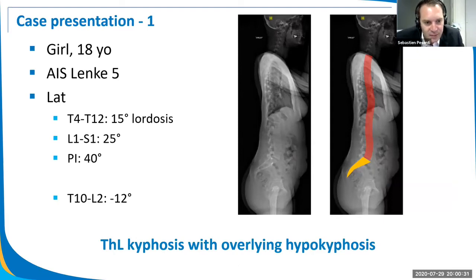And there is a thoracolumbar kyphosis of 12 degrees that corresponds to the apex of the scoliosis. Sebastien, it is a type 2 of the sagittal idiopathic scoliosis classification of Abelin-Genevois, right? Yeah, that's it, with a thoracolumbar kyphosis. Yes, I think it's 2B, with the lumbar kyphosis.